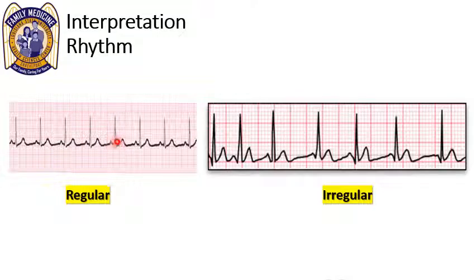Now sometimes they're not as obvious as this, where you have a bunched up QRS complex next to the other one. Instead, it'll be regular and then maybe a little irregular and regular, and that's when they say to bust out the calipers. I don't carry a pair of calipers with me, so you may just have to continue to try and evaluate that rhythm with your eyes, and you can also, on the PDF version of the 12-lead printout that you get on Epic, use a ruler function and see if it's the same distance in between.